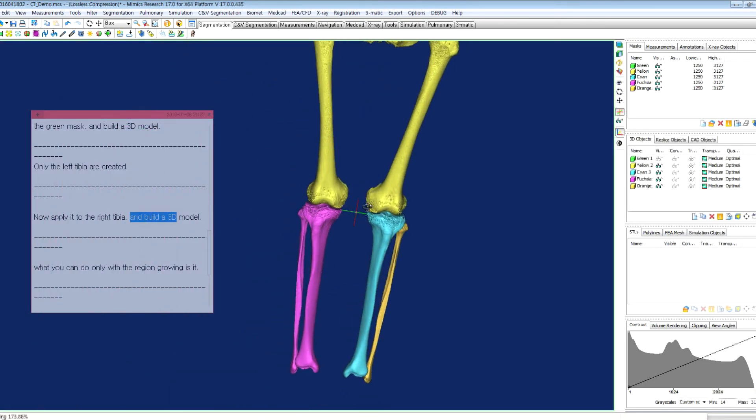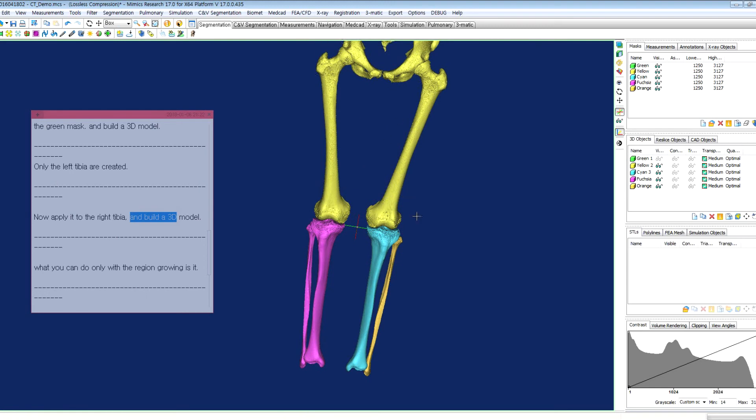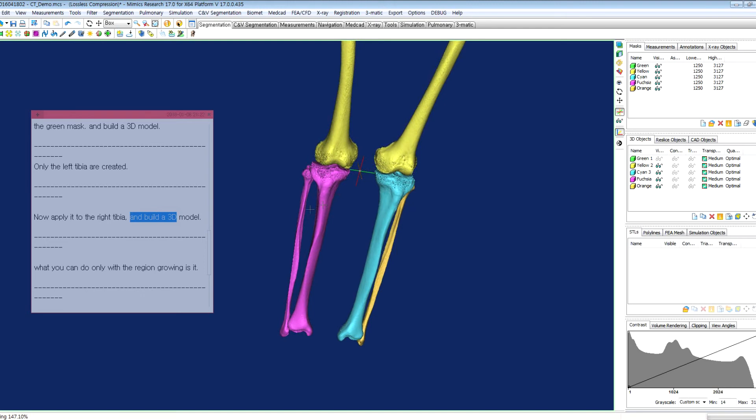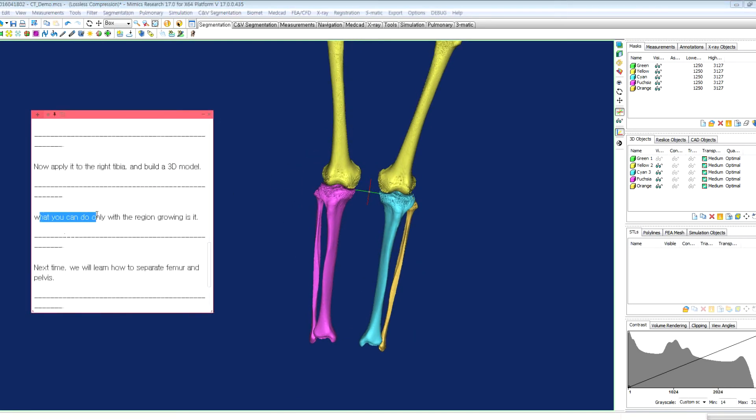Here we have the femur and pelvis, and the left tibia, left fibula, right tibia, and fibula. That is what you can do with region growing alone.